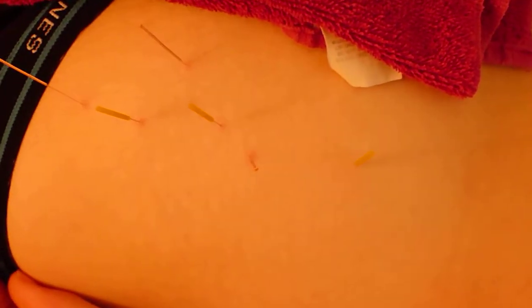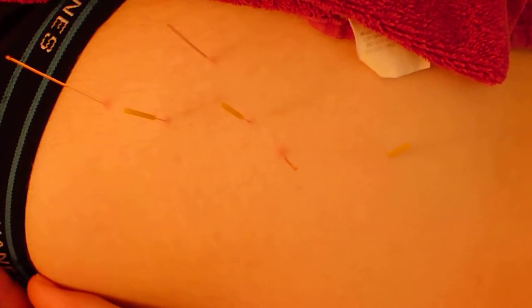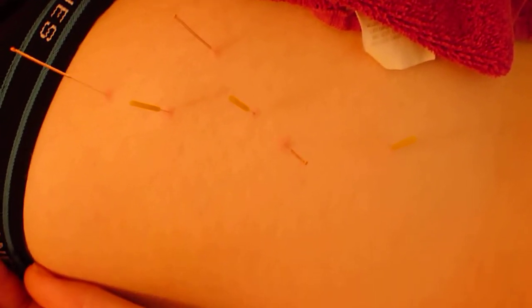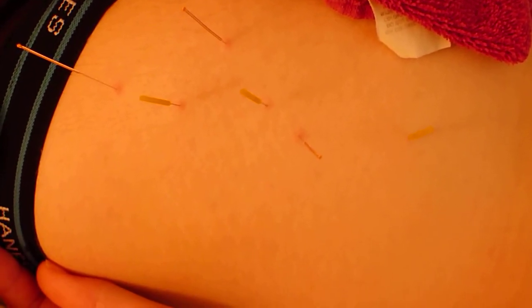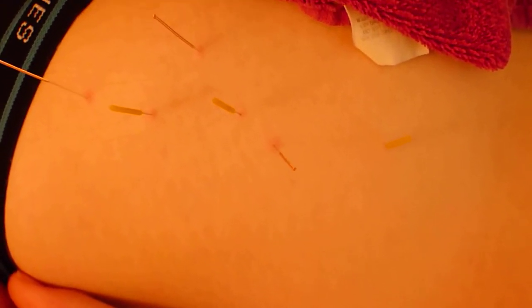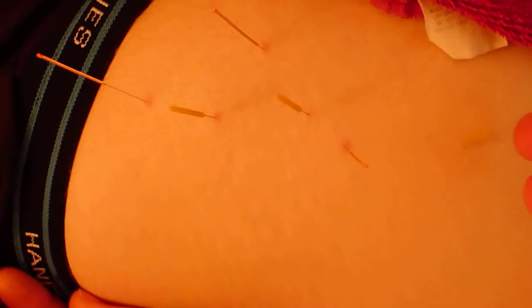I have done dry needling on his right buttock. He has severe hip pain that would appear to be of myofascial origin — he doesn't have any neurological symptoms. He does also have a bit of a history of lots of tightness in his muscles, so I have released his gluteus medius and minimus there.